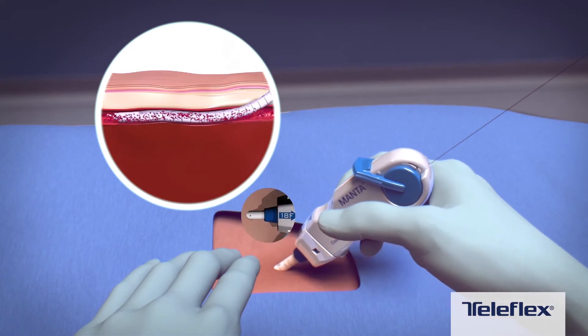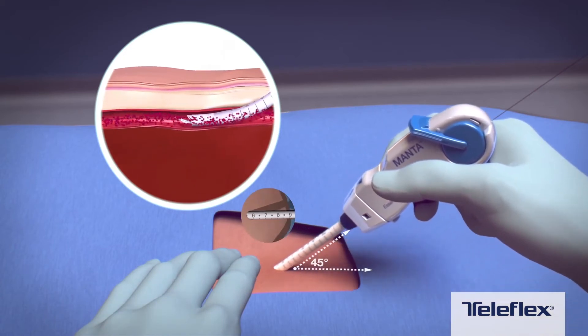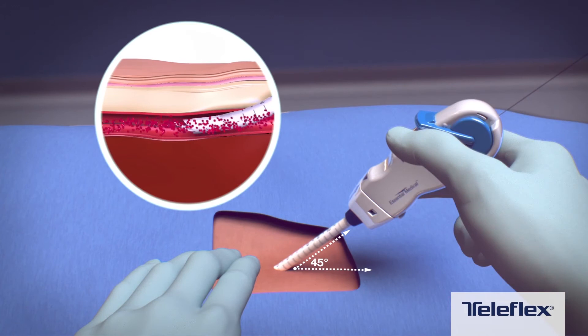Slowly retract the device and sheath at a 45 degree angle, observing the markings on the sheath until positioned at the previously determined deployment depth.